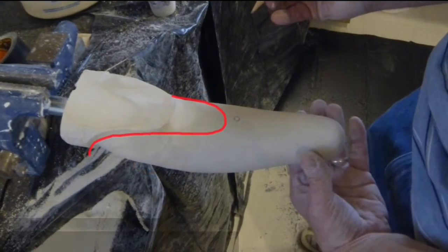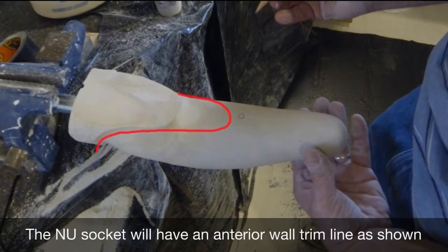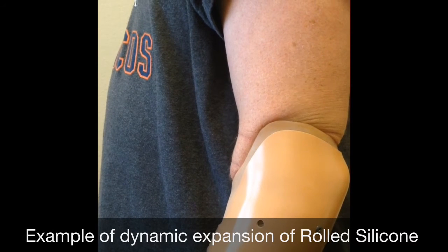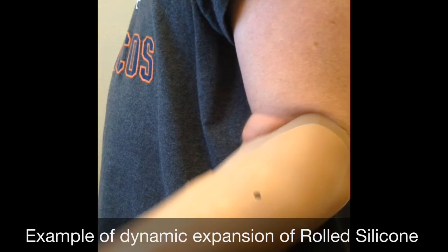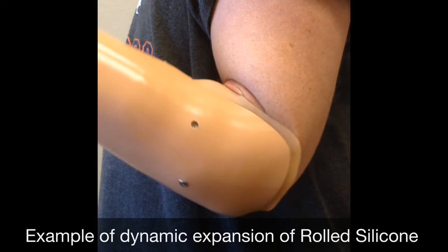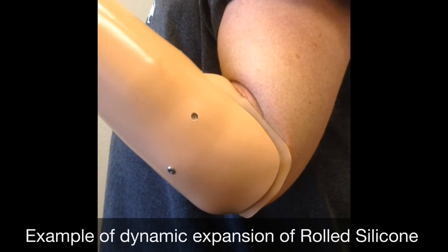If a thermoplastic socket will use a Northwestern socket as described by Billock, the anterior wall trim line will be modified as illustrated with the red line. Rolled silicone accommodates expansion of the tissue distal to the antecubital fold and olecranon prominence by dynamic expansion due to the elasticity of the material as shown.